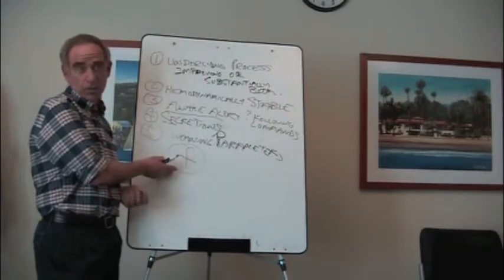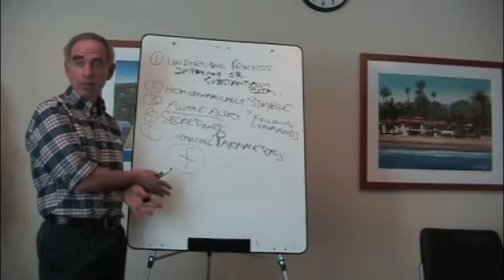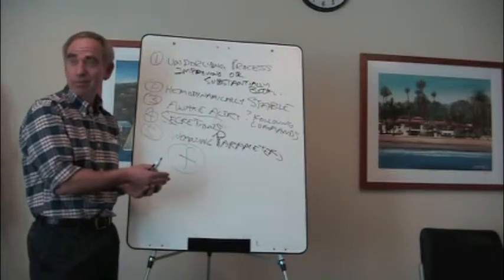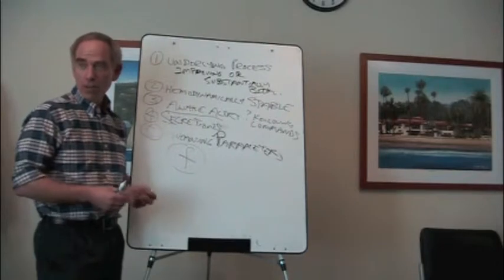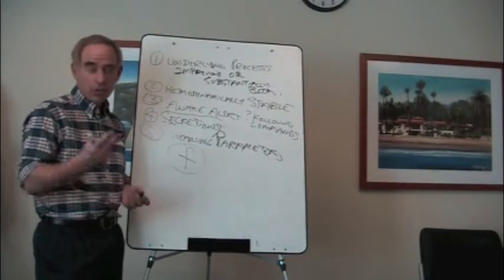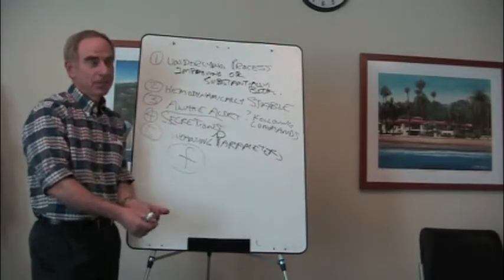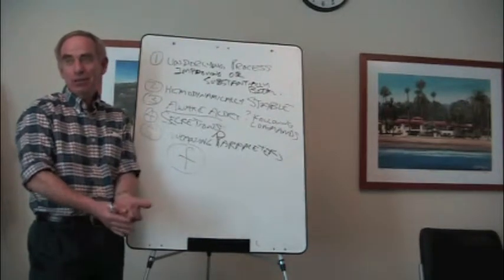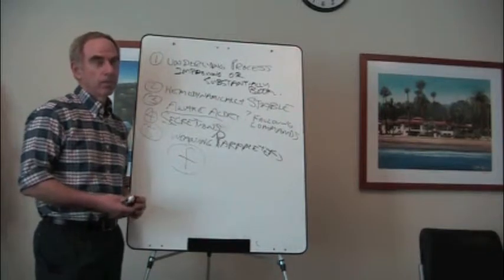So actually, respiratory rate is a very key weaning parameter. In fact, to me, it's probably the single most important thing, even though the studies show rapid shallow breathing index. But what are the components of the rapid shallow breathing index? The two things that I told you that integrate everything together are the rate and tidal volume. And that's why it's such a good predictor, because that's really telling you the whole story, big picture. Okay?